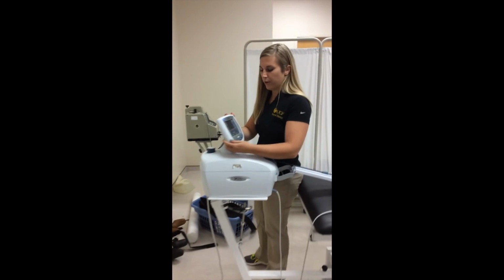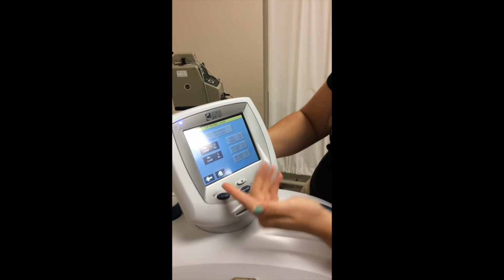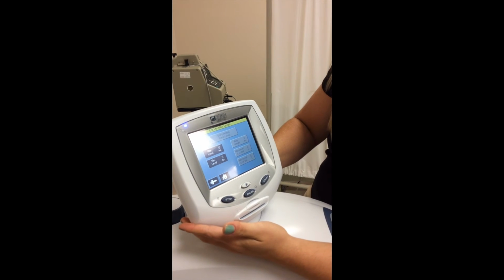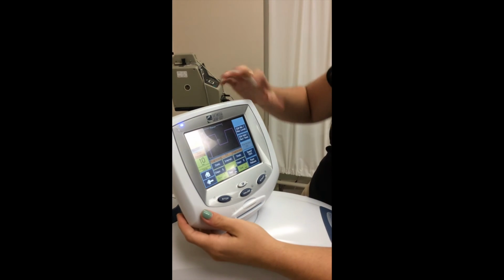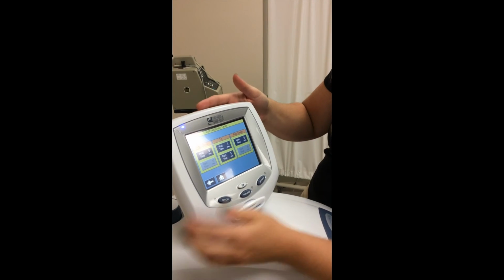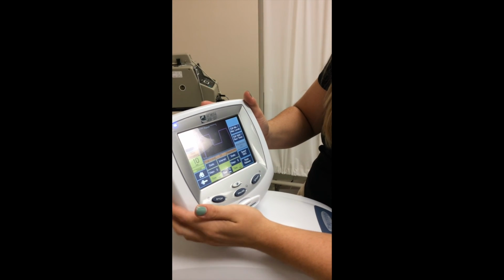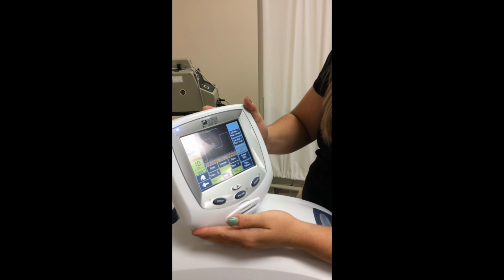And now for the parameters of the treatment, this is the force that's going to be used. It's from 11 to 15 pounds is max, but this is her first treatment, so we're going to have max at 12 and min at 5. The hold and relax time will always be 5 seconds on and 5 seconds off. And normally you can do it between 20 and 30 minutes, but we're going to start with 10 minutes since, again, this is her first treatment.